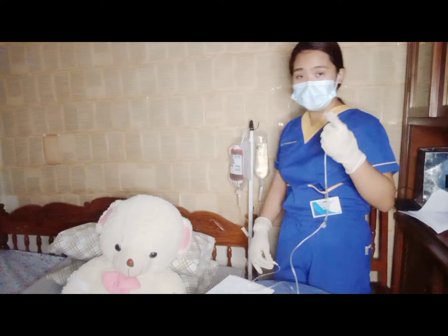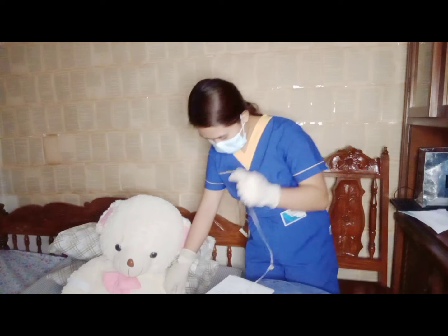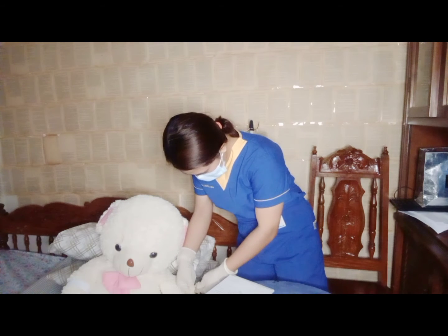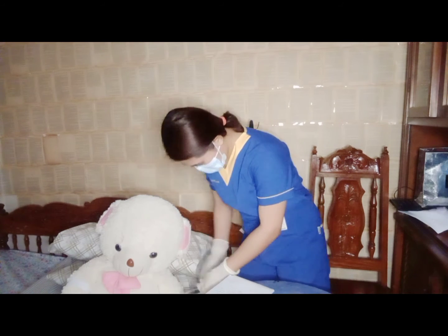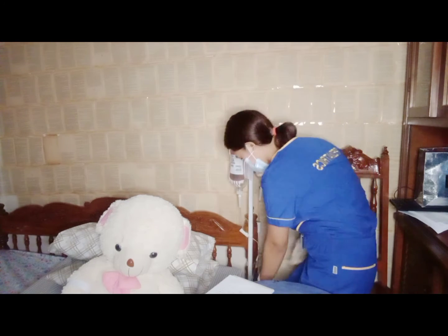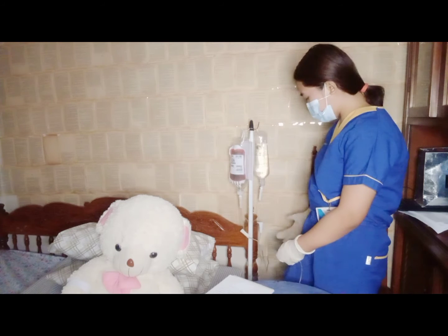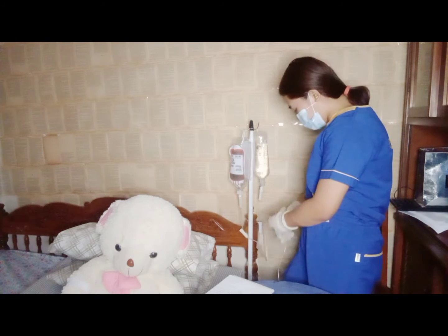So, let's start to administer the blood. We need to adjust the flow rate until the prescribed rate is achieved.